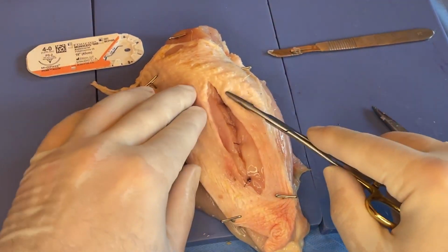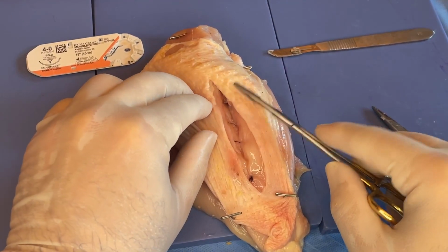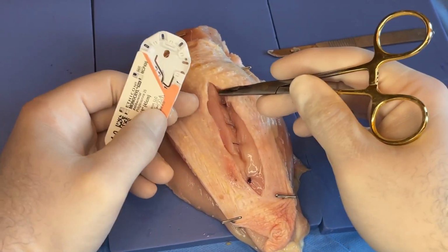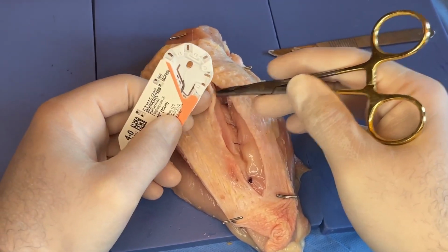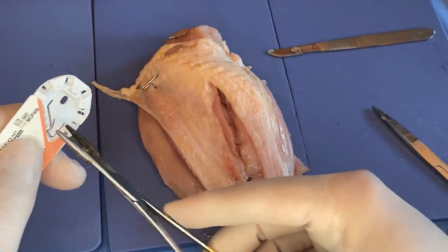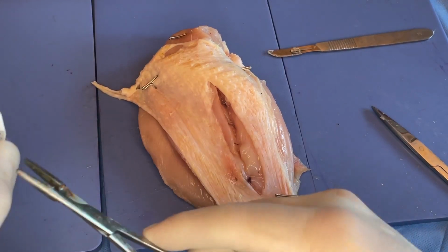All right, so now we've got essentially the deeper area of this closed, and we're going to kind of simulate a subcuticular closure here. So we're not going to be going only through the skin itself, but just kind of treating that as if it was one thing. So we'll hope that the skin kind of stays stuck to that, although it's not. But I'll show you how I kind of approach these in general.